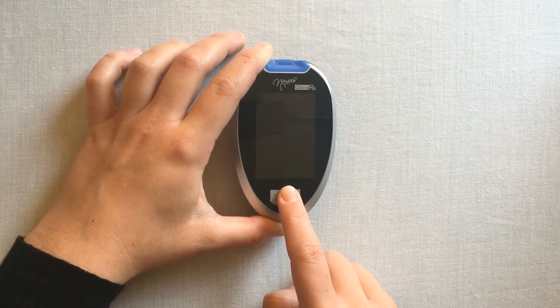To review your averages, press and hold the main function button until you see 'average' flash in the bottom right hand corner. You can then release this button.